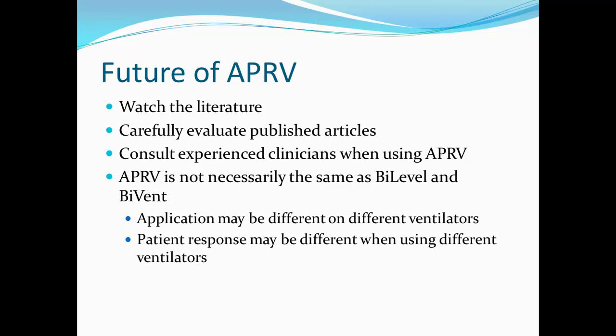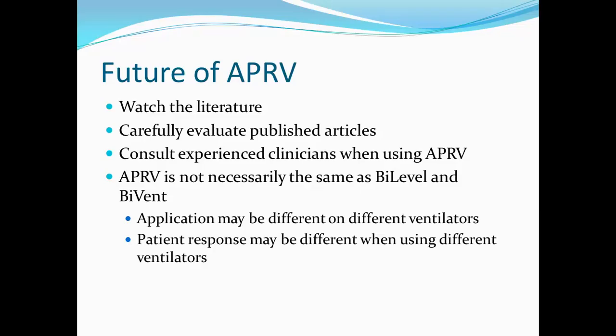I also think that even though ventilators have different modes on them that may appear similar, like bilevel and BiVent, I honestly do not feel that bilevel, BiVent, and APRV are the same thing. I think that applying those different modes on different ventilators will have a different effect on patients. I think the patient's response will be very different, and I'm not convinced that they really are the same mode. So those are some of my thoughts.